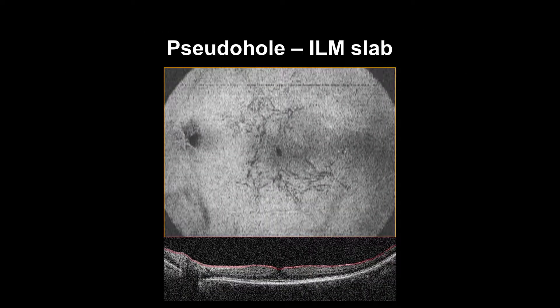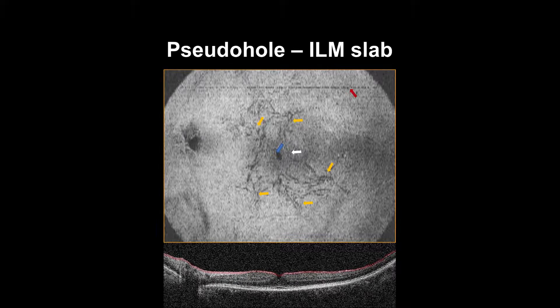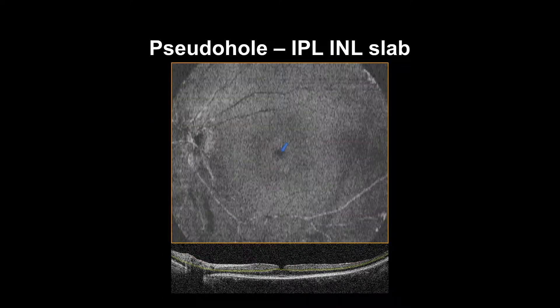In cases of pseudo-hole, the ILM slab will feature hyporeflective circles surrounded by another smooth circle, and radial folds will emanate forming a sunflower pattern. Please note the blink artifact. On the IPL-INL slab, the pseudo-hole will appear more circular as it shows the base of the foveal verticalization.